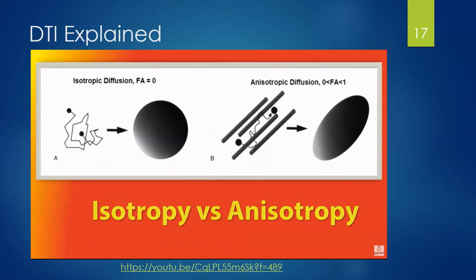So the diffusion that I just showed you in that flask of water is very much like this round cell where the diffusion is very random in all kinds of directions, actually an infinite number of directions. What we're looking at is the axon, which is on your right here, and it is linear and it's directional. So that myelin sheath that I told you about, the axon, keeps the water moving in a certain direction, or the water molecules. And that allows us something that we can measure with diffusion tensor imaging. Let me give you an example.